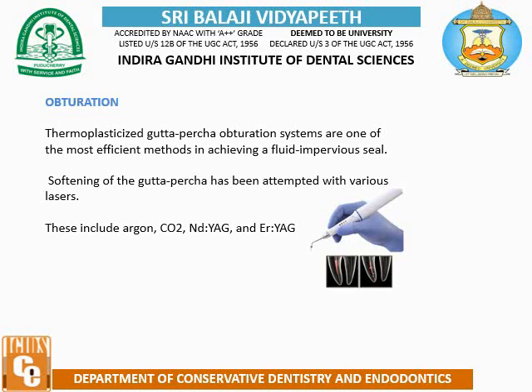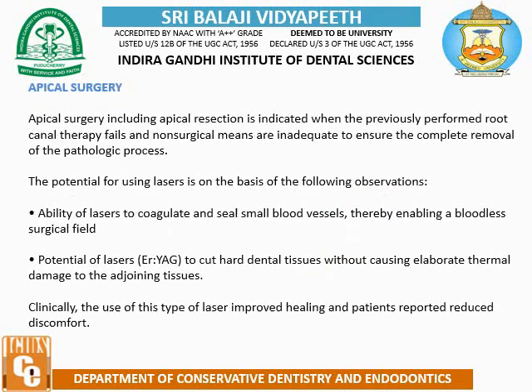Softening of gutta percha has been attempted with various lasers. These include argon, CO2, Nd:YAG and Er:YAG.